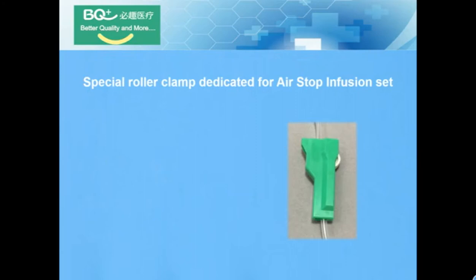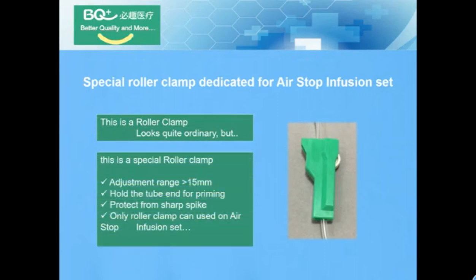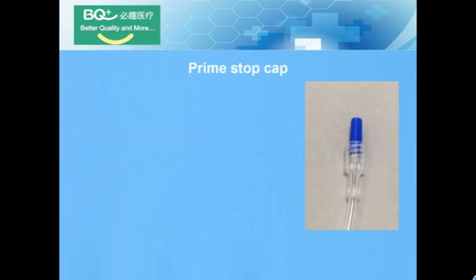Special roller clamp dedicated for the Air Stop Infusion Set. This looks quite ordinary, but this is a special roller clamp. The adjustment range is greater than 15 mm. It holds the tube end for priming and protects from a sharp spike. That is the only roller clamp that can be used on the Air Stop Infusion Set.